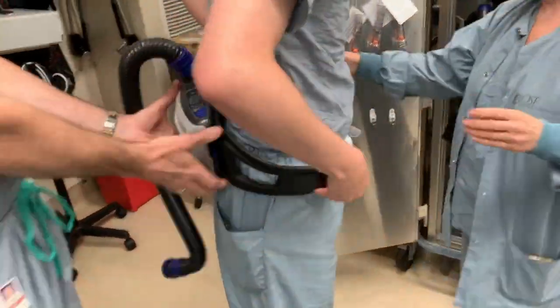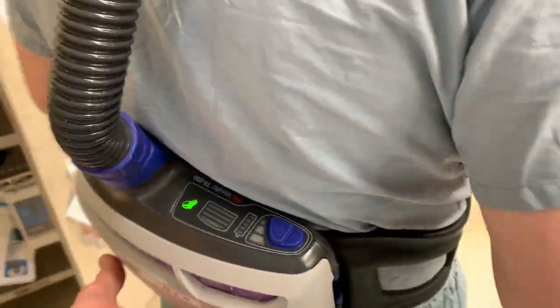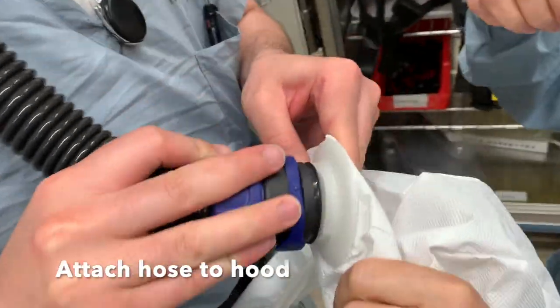You then attach the hose and put the pack on, having a buddy help you out. There will be people in the room to help guide you through this process.